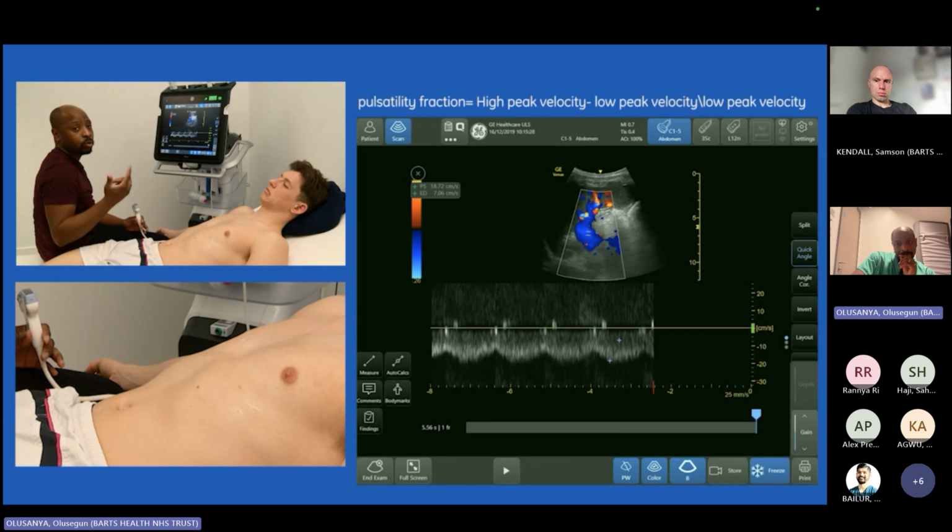He's got a distended IVC. He's got severe abnormality in his hepatic vein, and he's got severe abnormality in his portal vein. So I didn't actually bother doing his kidneys at that point in time because I had the answer. So the treatment for him was not a laparotomy. The treatment for him was actually inotropes and decongestion.